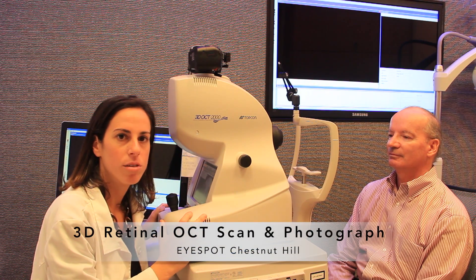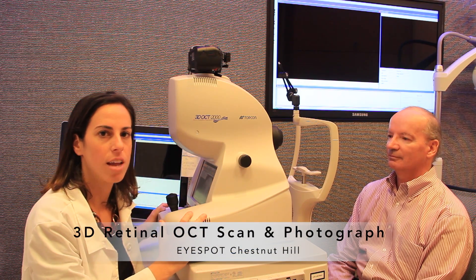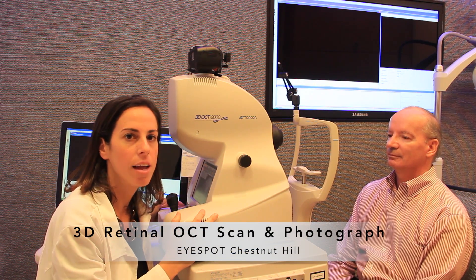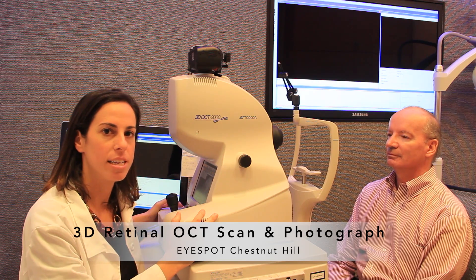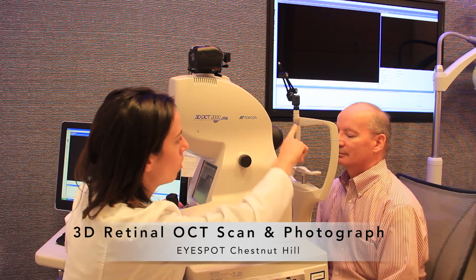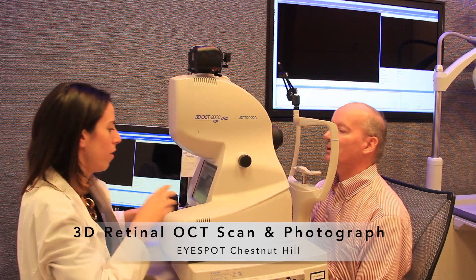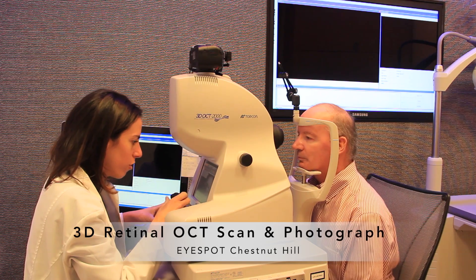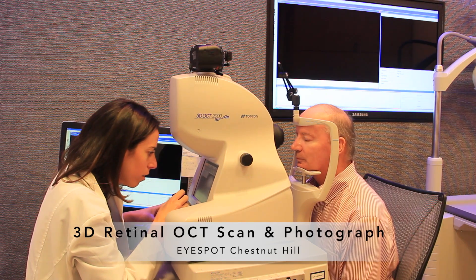This is our 3D OCT, and it takes a picture of the back of the eye in a 3D scan. If you'll come on forward, put your chin in the chin rest, forehead in there, and just look straight ahead.